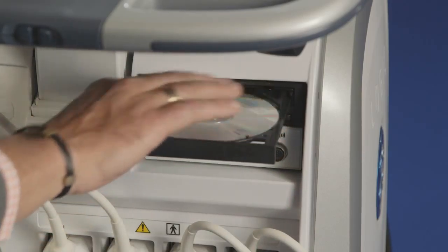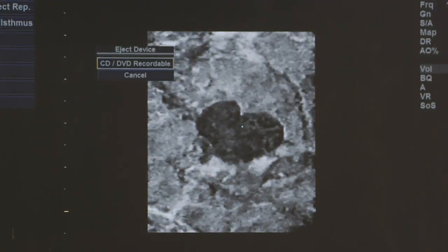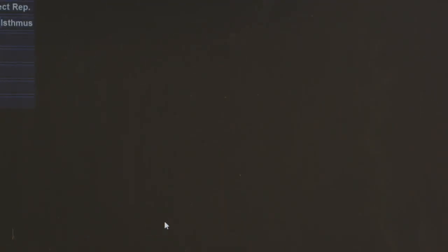To place the system in a steer position, push the left foot pedal down. To place the system in the lock position, push the right pedal down. And to unlock all wheels, press the small gray pedal between the steer and lock pedals.